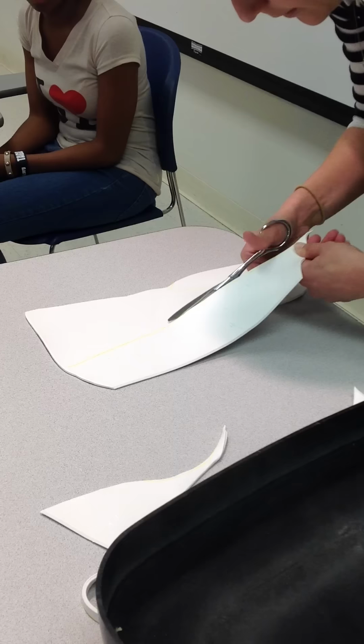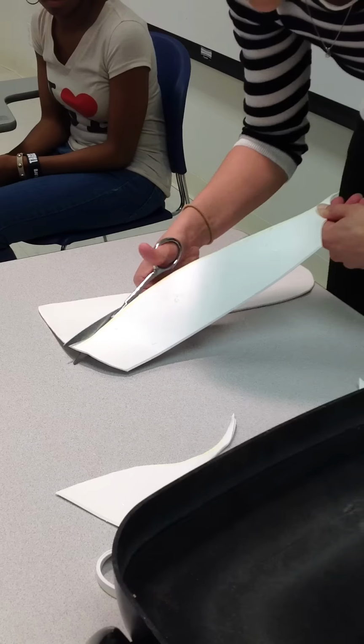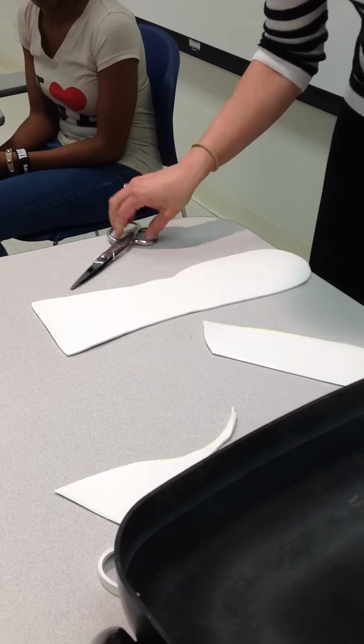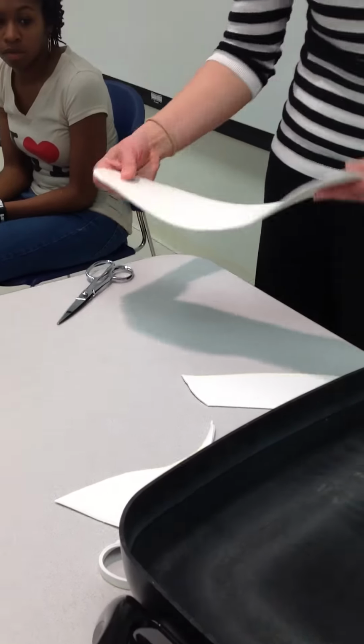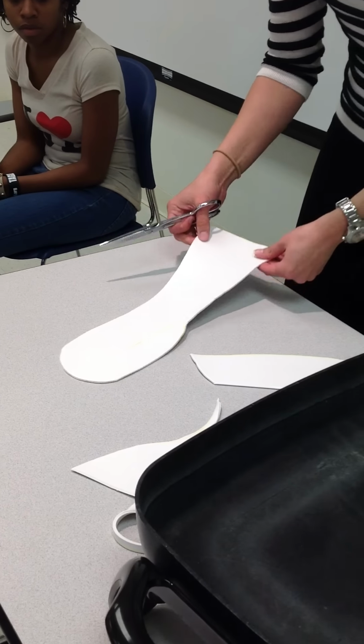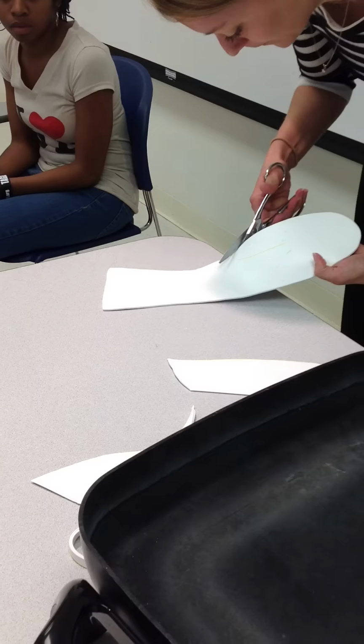Does this material have a high memory? Yeah. Does that material stick to the table as bad as that? Well, it shouldn't. The Aquaplast shouldn't have been as bad as it was either. I don't know if it's just the splint pans or what's going on with it. Will it stick to itself like that? Yeah.